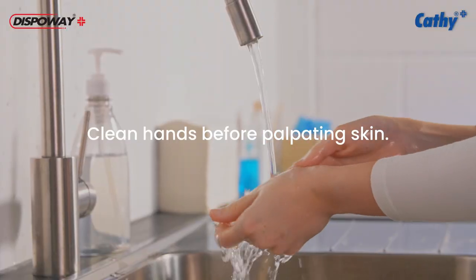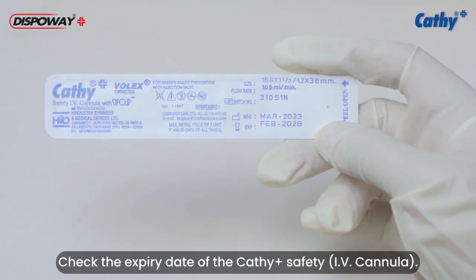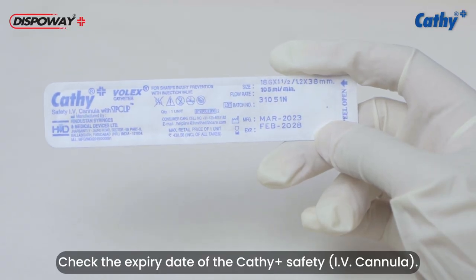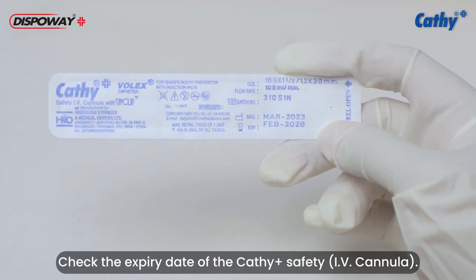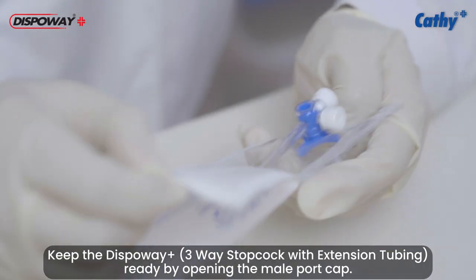Clean hands before palpating skin. Check the expiry date of the Cathy Plus Safety IV Cannula. Keep the DispoVay Plus ready by opening the male port cap.